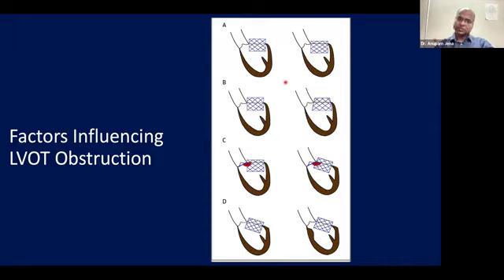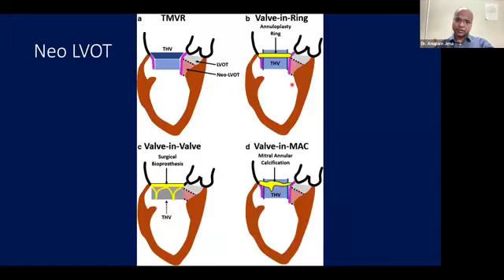The most important acute problem is LVOT obstruction. LVOT obstruction can be there because of flaring, depth of implantation, orientation, and finally the native parameters are also very important. If the patient has a narrow LVOT, then it's a difficult situation. So either do a LAMPOON or something.